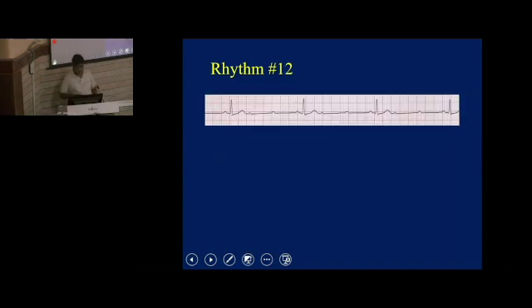Okay. What about this rhythm? What is the problem? Rate, rhythm, PQRST complex. Let us again concentrate because we are dealing with blocks. Let us concentrate on the P wave or PR interval. What is the abnormality? So what do we see quickly? What is the finding? Heart rate, okay, leave the rhythm. What about the QRS complex? Beat drop is happening, huh? Some beats are not conducting. Is that the finding?